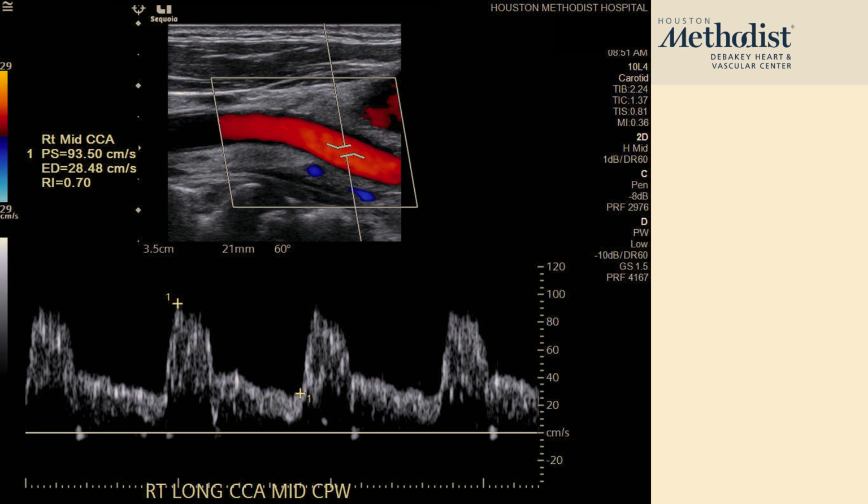And I noticed some snowing in the waveform. I want you guys to pay attention to what are those white spots. We rarely see snow in Texas, so this is why I hate to say, but that is something that we don't see every day in our carotid system.